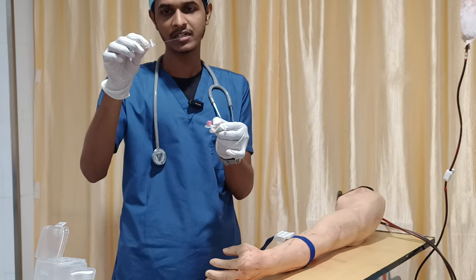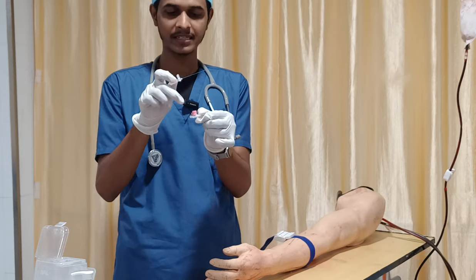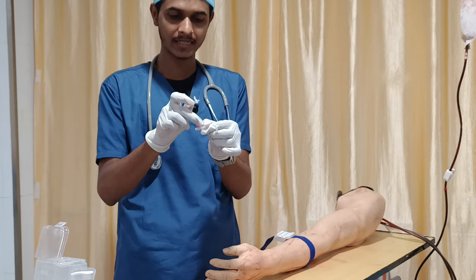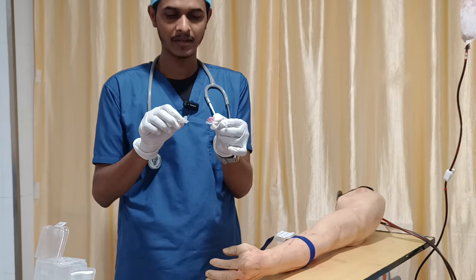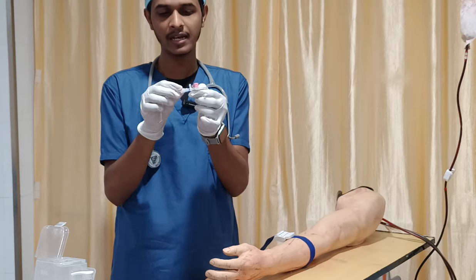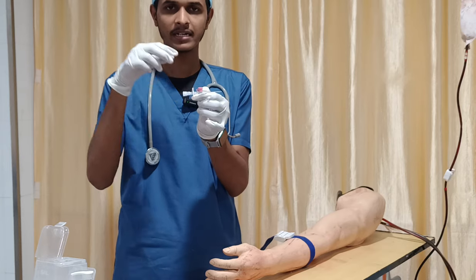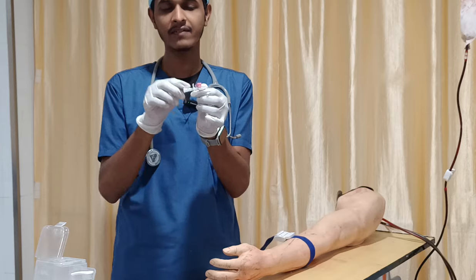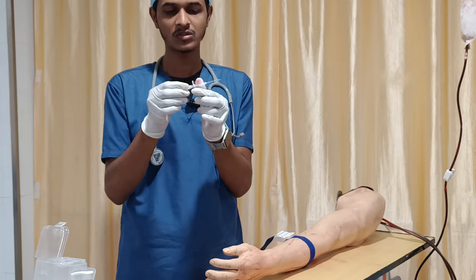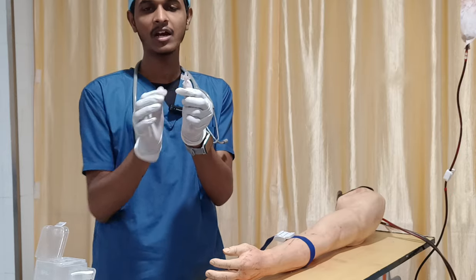This portion is the needle introducer. This plastic portion is your catheter, and the plastic catheter is attached to the hub of the catheter. Here we have a marker showing which size it is. Then we have the cap portion, and this portion is called the needle stopper. On the back side we have a flashback chamber, and one more hub also. And this wing is called the butterfly wings.